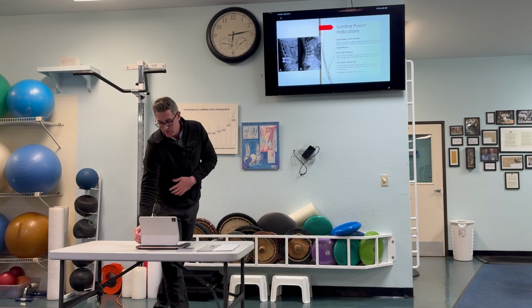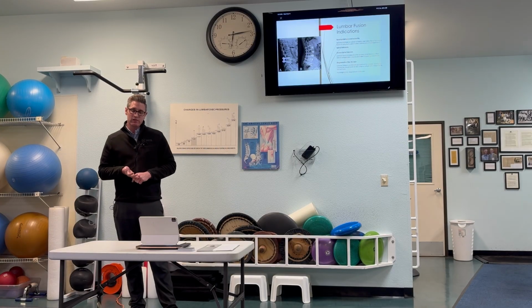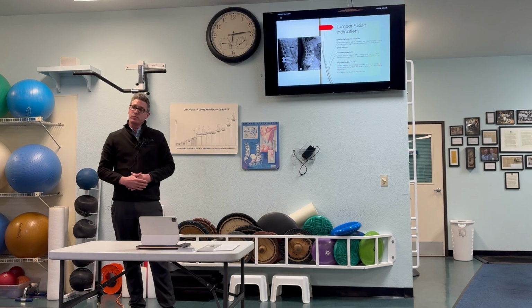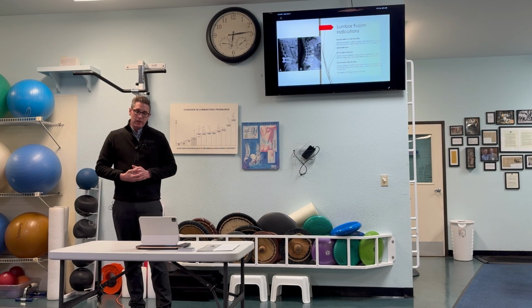So with regards to a fusion, as we touched on before, this is usually done in the form of screws and rods, as we would say, and sometimes can be performed with what we call interbody devices. We can see that on this picture on the left, these metal spacers are placed into the disc space to hopefully replicate the typical size, shape, and structure of the disc and provide appropriate alignment to the spine to give the patient the most appropriate sagittal alignment and coronal alignment, which translates to good overall outcome.